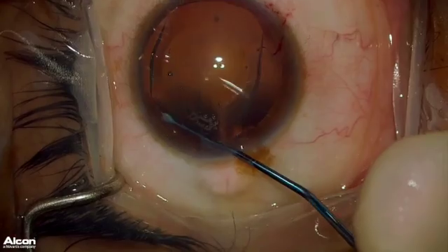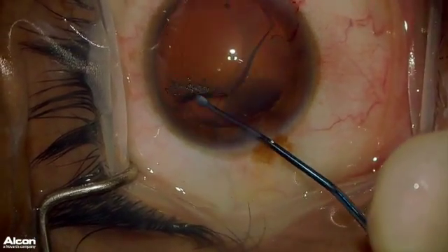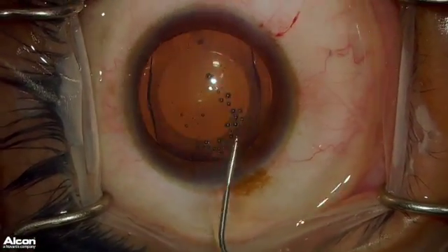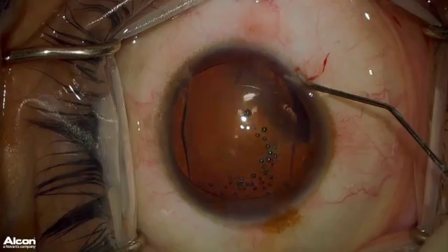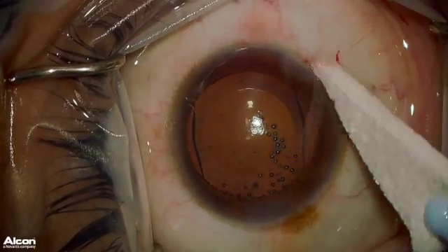Nasal footplates done first, and then the temporal footplates. Positioning the ICL appropriately, and now removing the remainder of OcciCote with BSS solution by washing out the anterior chamber. I like to use the main wound and then the paracentesis side. Now just making sure there are no leaks, and that concludes this surgery.